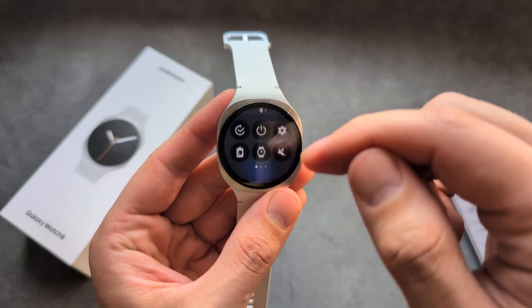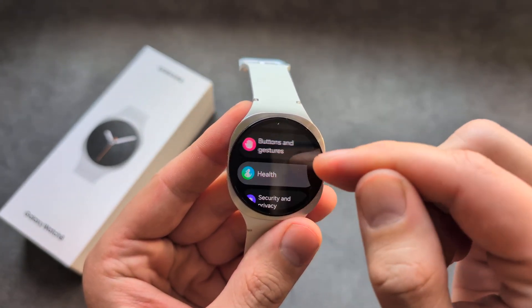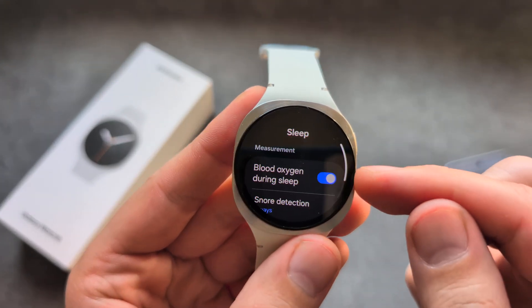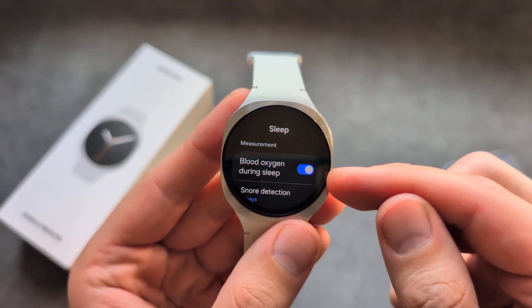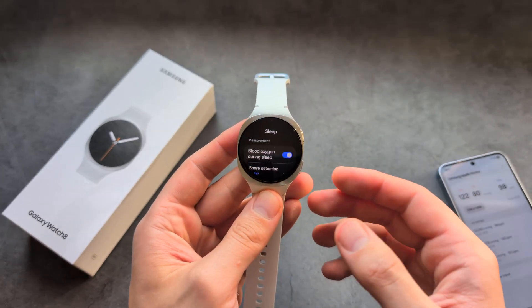Also on the watch, make sure to go into Settings, then Health, then Sleep. Make sure you have enabled blood oxygen during sleep. If you do not enable this, the sleep apnea feature won't work properly.